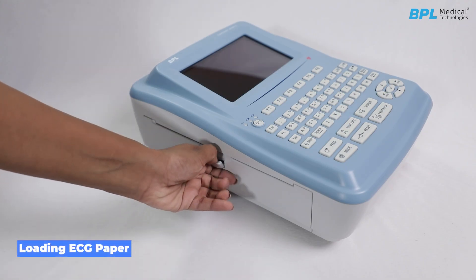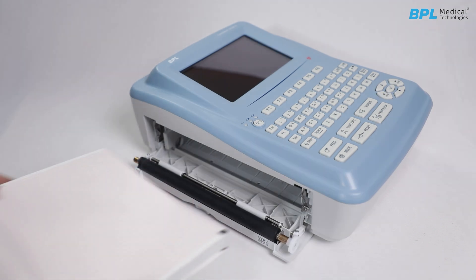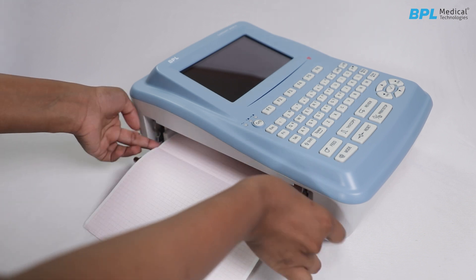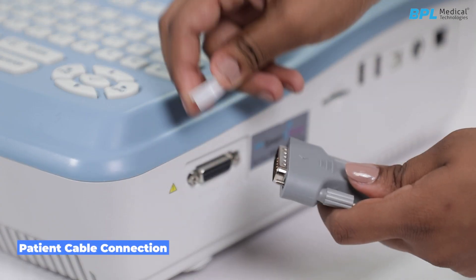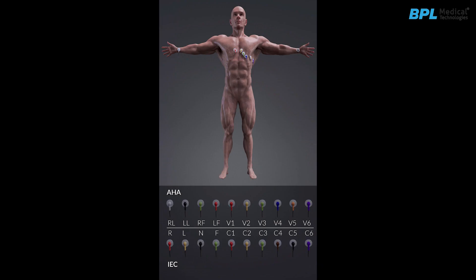To load the ECG paper, push the casing button down to open the recorder. Insert the new folded paper into the paper tray. Make sure the grid side of the thermal paper faces the thermal printer head, then close the casing. Use the specified color codes of electrode connectors to comply with IEC requirements.